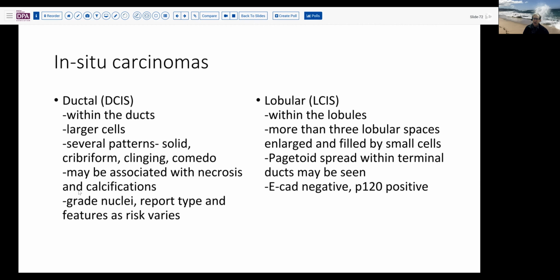In addition, of course, there are overlap areas or gray zones with ductal carcinoma in situ and atypical ductal hyperplasia. Again, the criterion is the number of ducts that are affected and the extent of the changes, so recognizing that that's a more difficult cutoff sometimes for many practitioners.